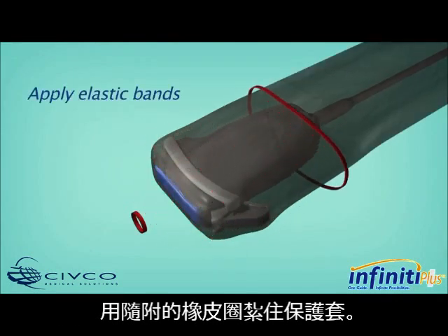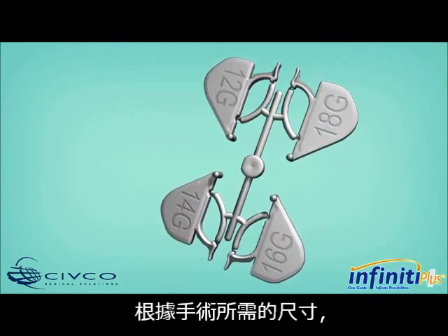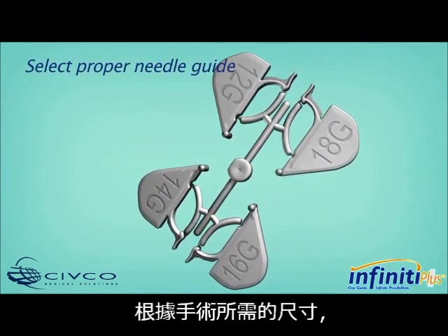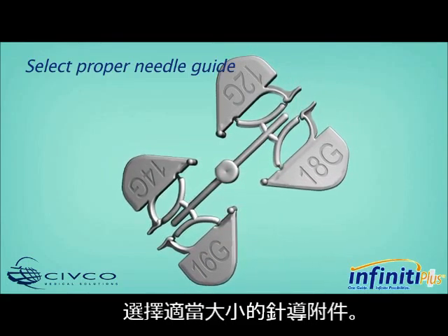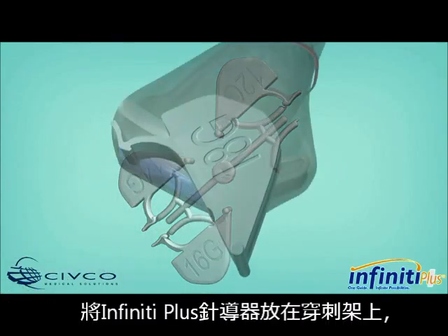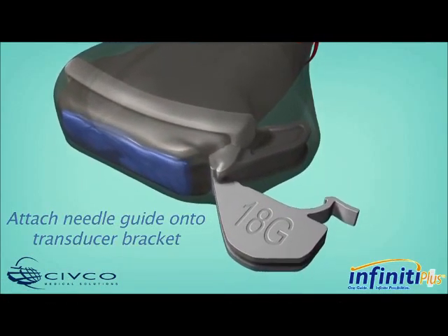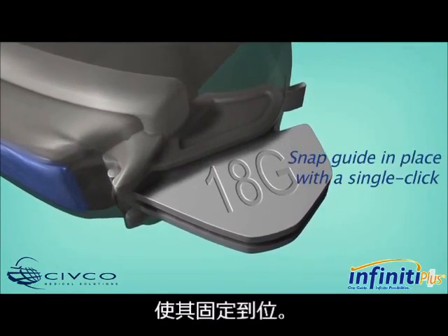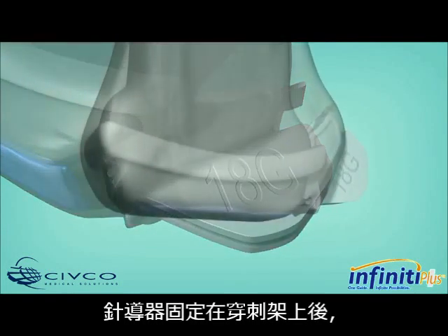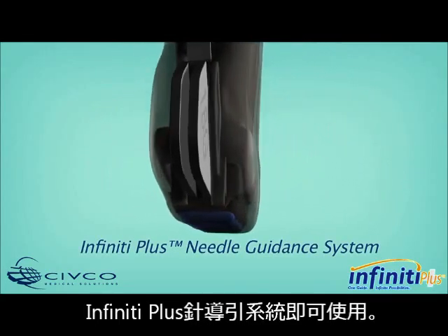Apply the enclosed sterile elastic bands to secure the cover in place. Based on the size of instrument being used for the procedure, select the appropriate needle guide gauge size attachment to access the targeted anatomy. Attach the Infinity Plus Needle Guide onto the transducer bracket and snap it in place with a single click. Once the needle guide is secured to the bracket, the Infinity Plus Needle Guidance System is ready for use.